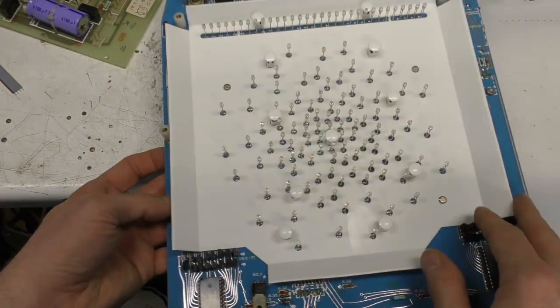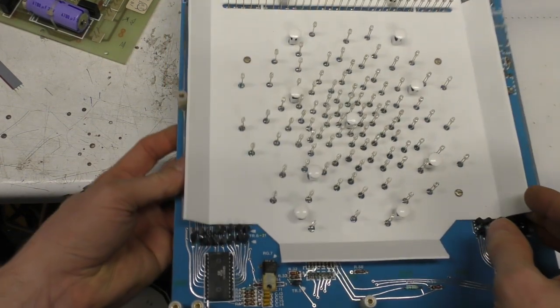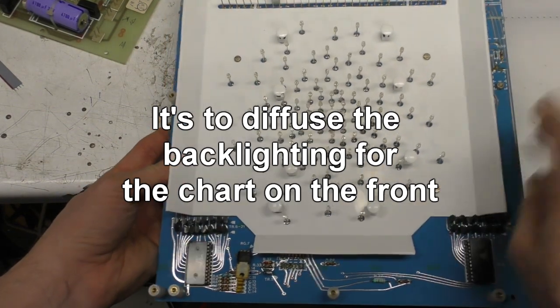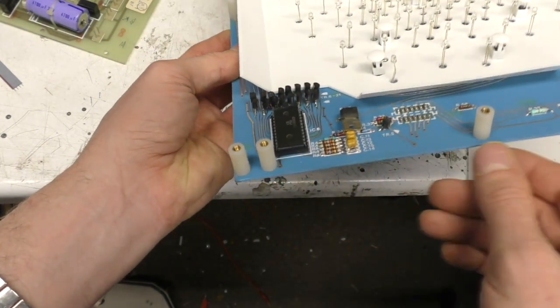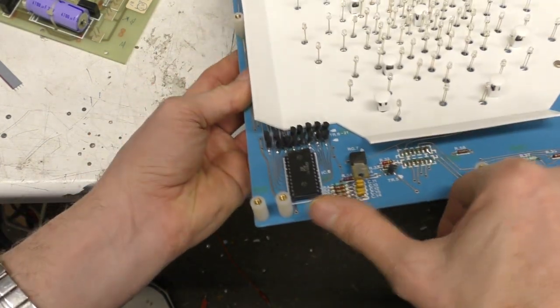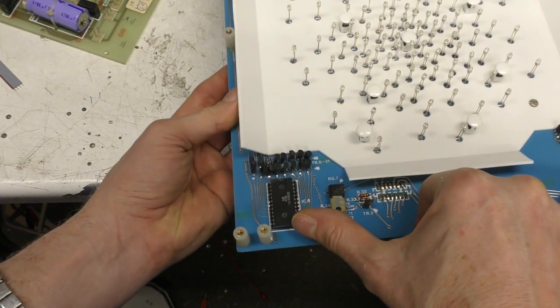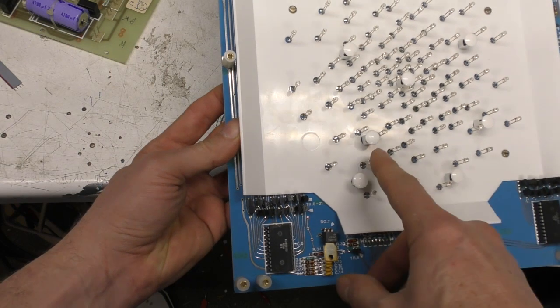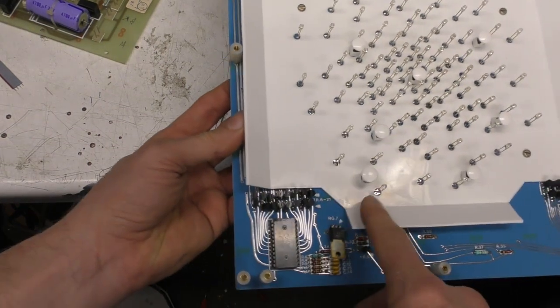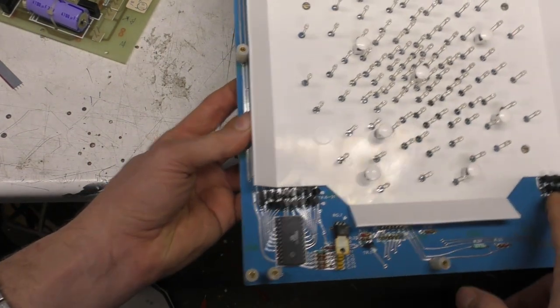There's all this white reflective stuff, which I can't really see what function that does other than make the PCB look less like this horrible blue fiberglass stuff. There's a couple of 16 channel analog multiplexers here, so that's probably used. I think the pattern select probably produces a BCD or similar code, and that's then decoded by this.